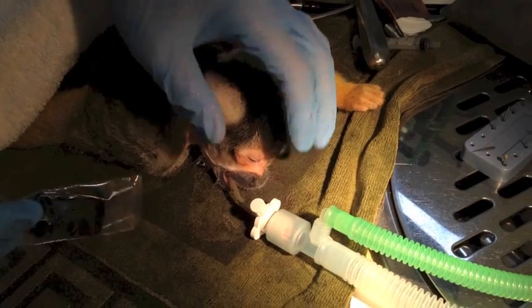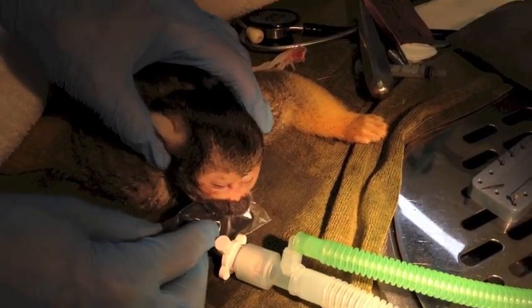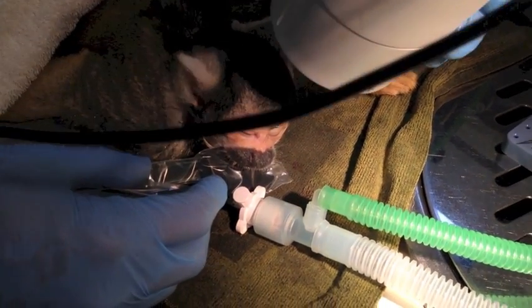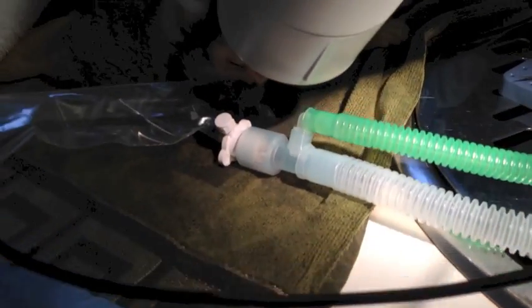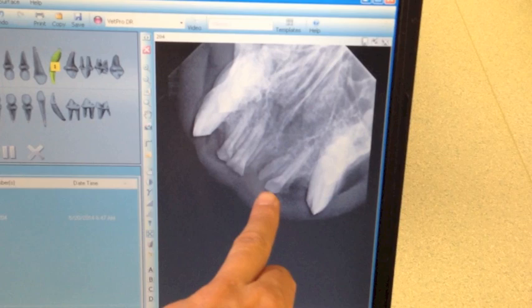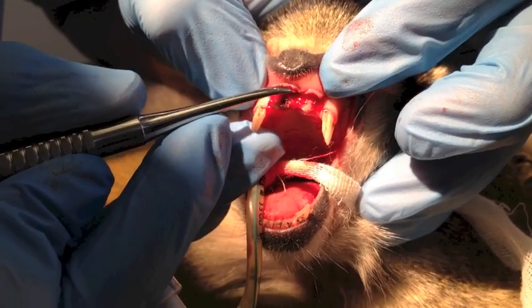So we're using dental x-rays, and dental x-rays are amazing things. We've got this amazing unit at Roundswell where we just get, with a push of a button, this instant picture of what's happening below the gum line. After carefully positioning Jake, we click our button, and boom, we can see what the problem is. All of a sudden, we can identify that there's a retained root in Jake's jawbone, and there's a serious infection going on around it. It's going to be uncomfortable, and it's going to be the source of the problems, and if we can deal with it, that should be Jake feeling a lot happier.